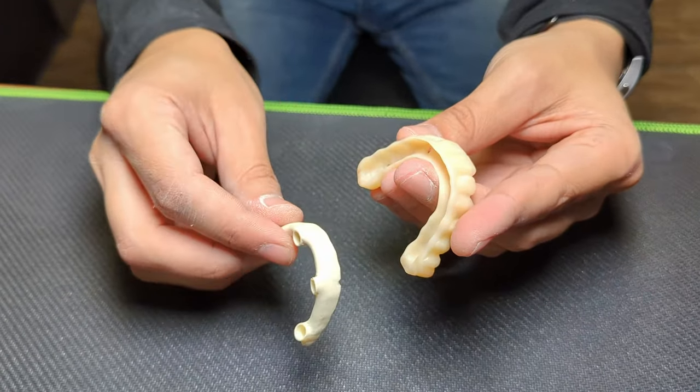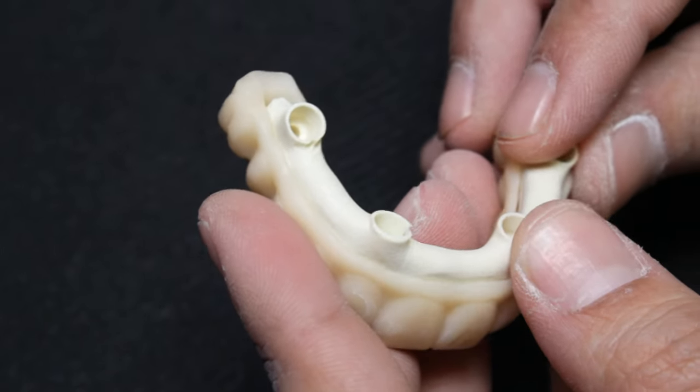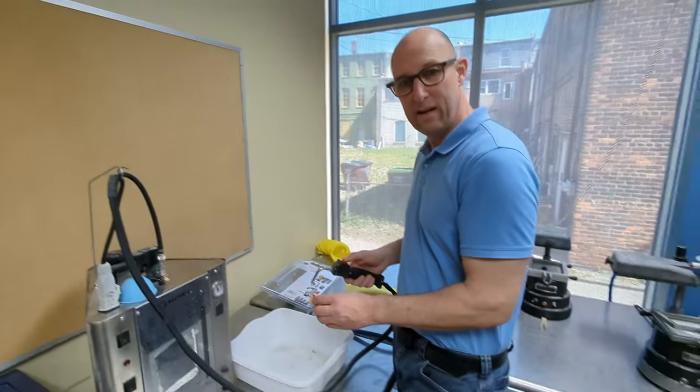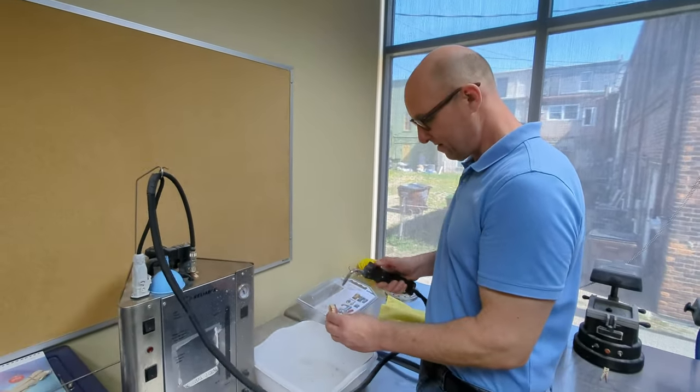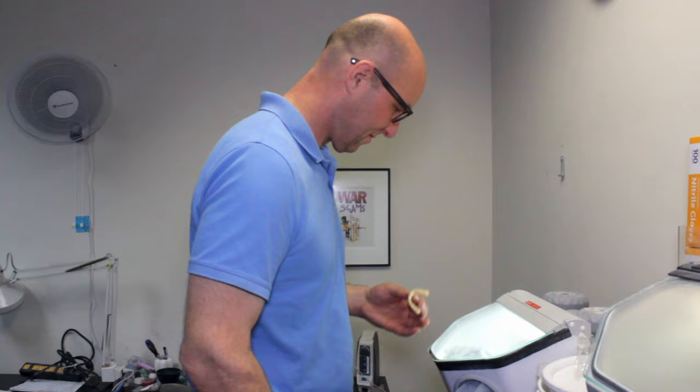After grinding off the sprue, I do a fit check to ensure a passive fit of the Trilor bar into the nano ceramic jacket. Before sandblasting the surface, especially the Trilor bar should be free of oil and dirt to avoid sandblasting those into the Trilor.